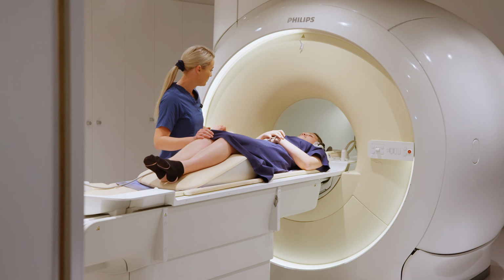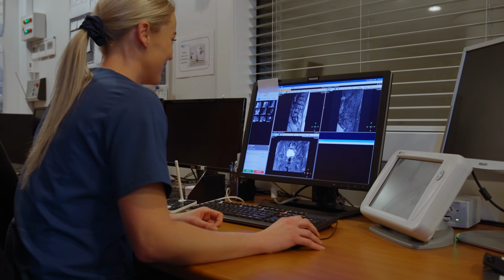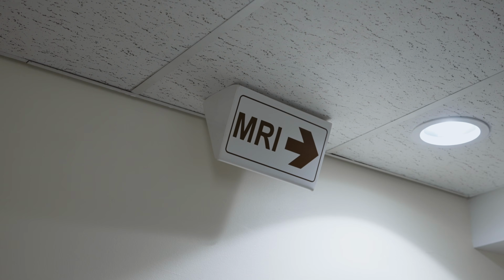We're able to see the vertebral bodies as well as the intervertebral discs between them, and whether any disease of those structures is resulting in impingement of the nerve roots as they leave the spine to supply the lower legs. And we also get a look at the spinal cord and the surrounding soft tissue structures. So we're able to pick up different parts of the spine and the patient's anatomy that may be contributing to their back pain or their referred pain to the legs.